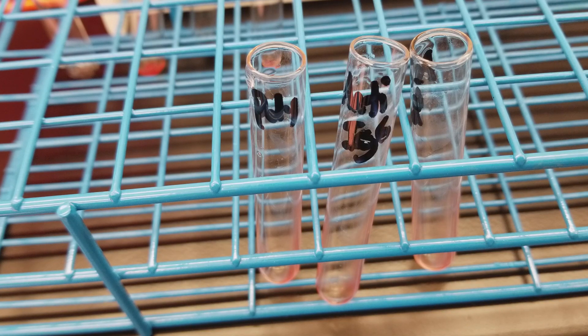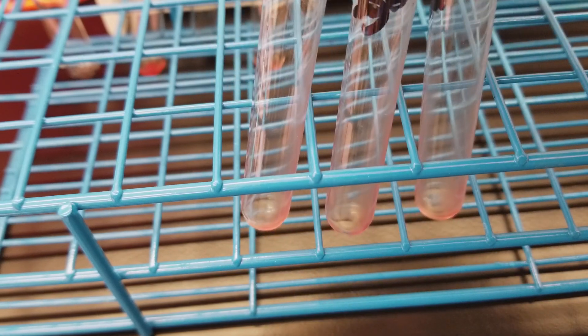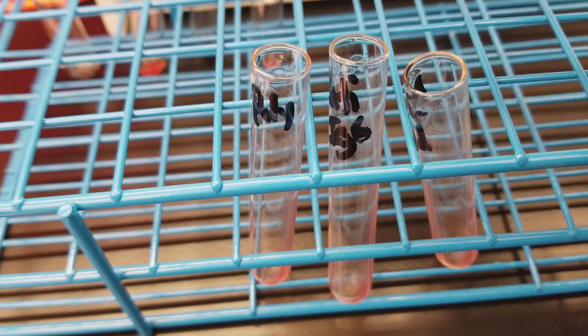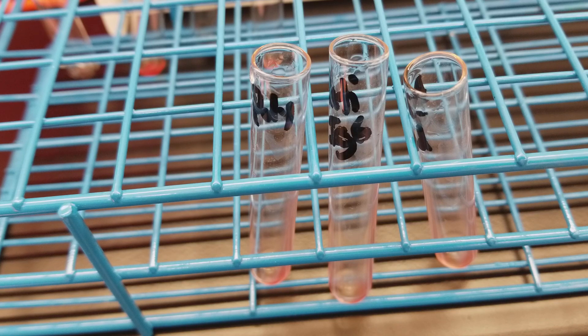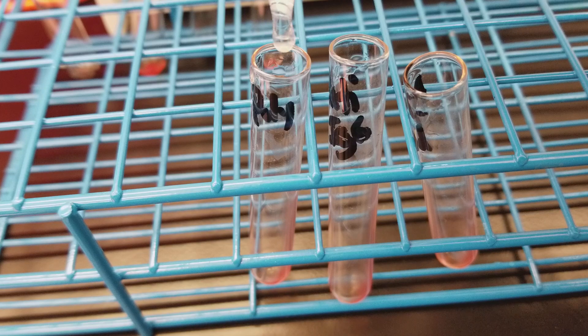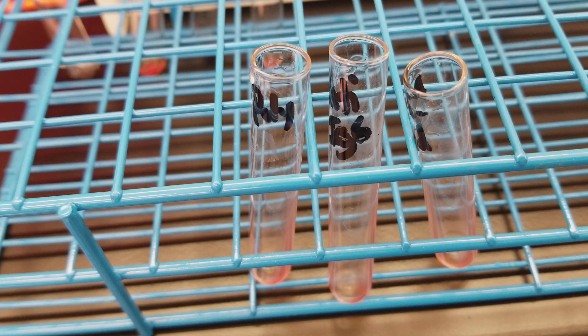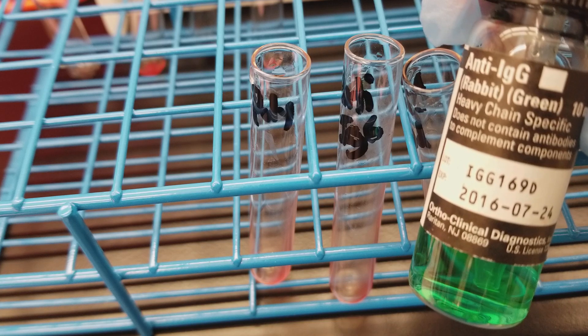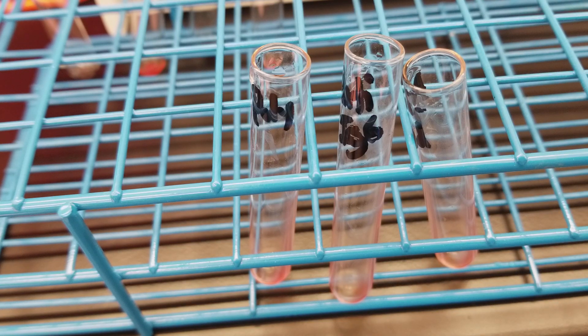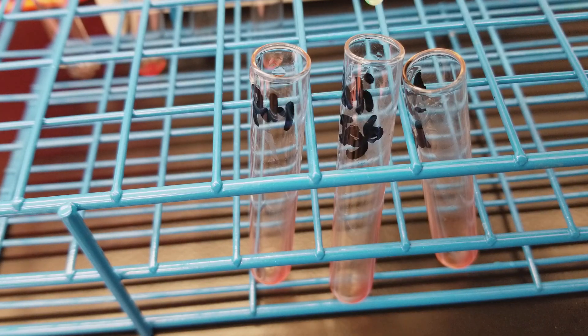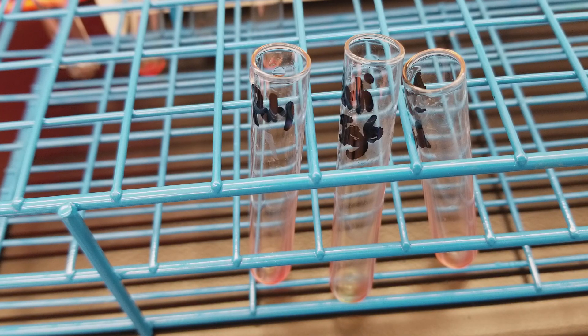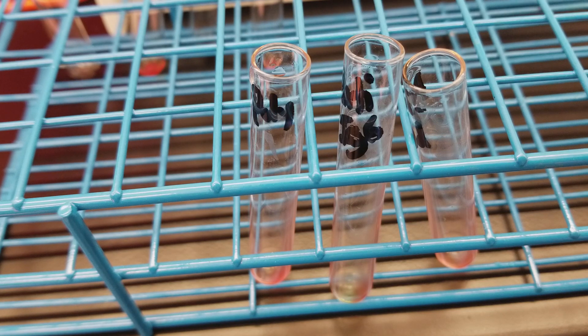I just did my washes and I decanted all the way. Now I'm going to add my reagents. So I have my poly IgG C3D here and I'm going to add one drop of each. I buy the green anti-IgG so that it will stand out and we won't accidentally mix up some stuff. So we're doing one drop of that. And then we're going to do one drop of the C3D, anti-C3D.